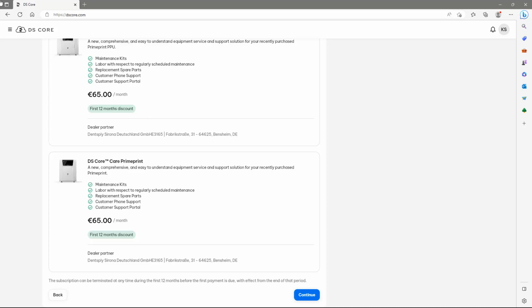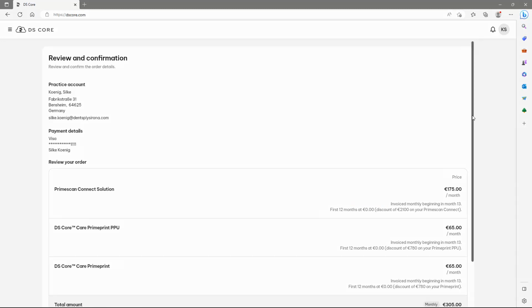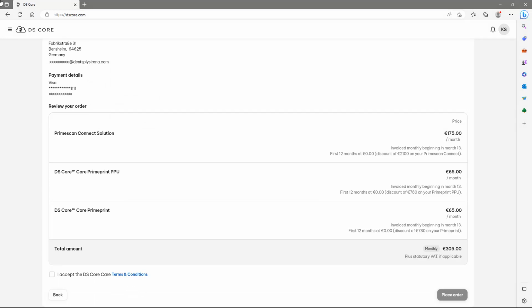In the bottom of each form, the service partner of the device is presented. After clicking on Continue, the final review and confirmation page is displayed. Here, we can review the detailed conditions of our order, for instance that the first invoice is due in month 13. After accepting the Terms and Conditions, we can complete our purchase by clicking on Place Order.